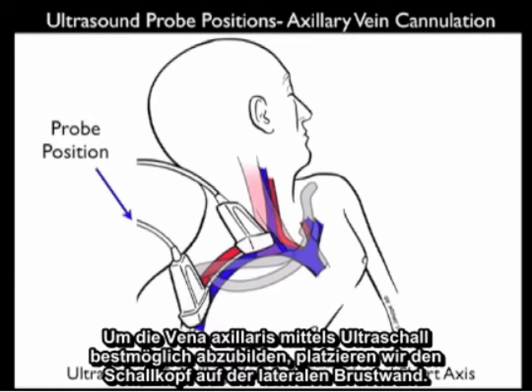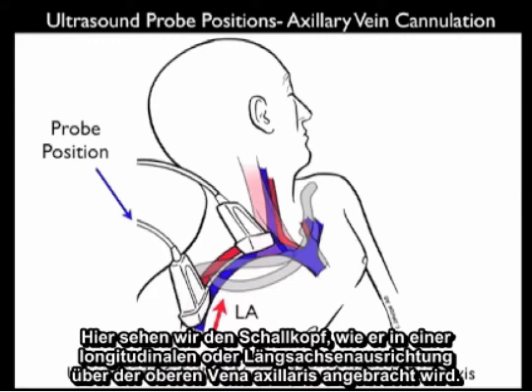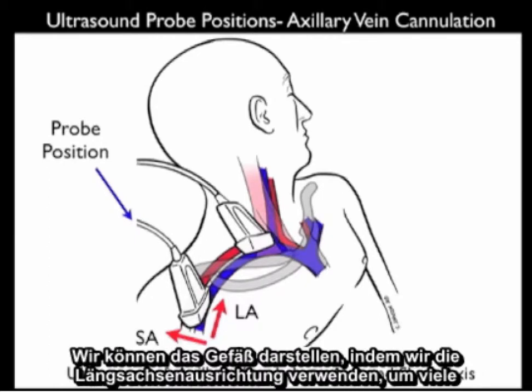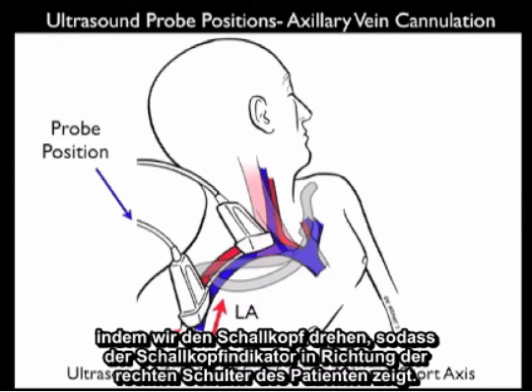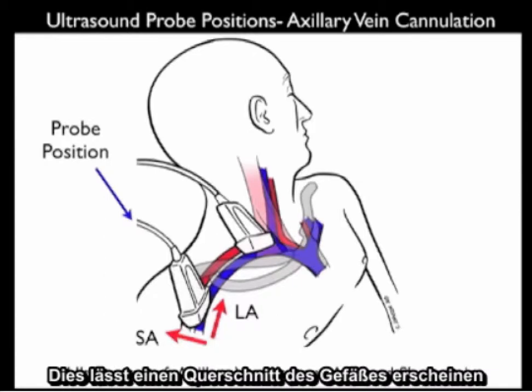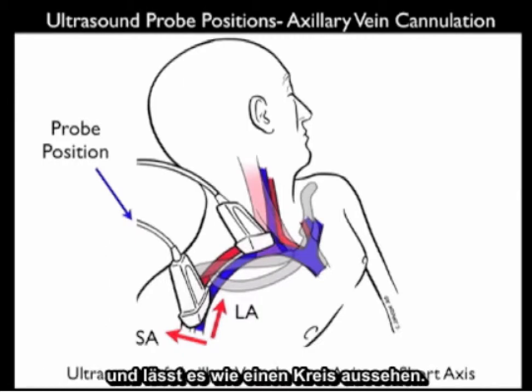To best image the axillary vein using ultrasound, we place the probe on the lateral chest wall. The probe can be applied in a longitudinal or long axis orientation over the top of the axillary vein to get detailed information about the vessel. We can also look in the short axis orientation by turning the probe so the indicator is towards the patient's right shoulder, cutting the vessel in cross-section so it appears as a circle.